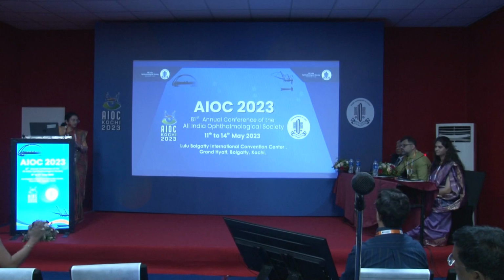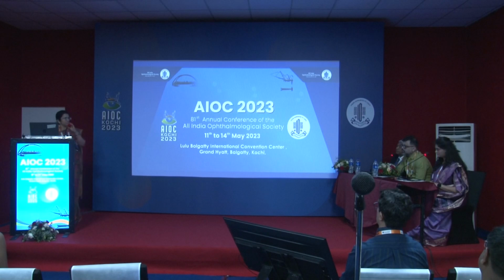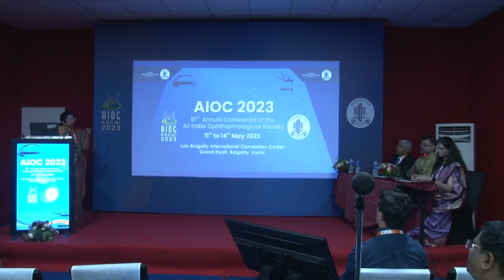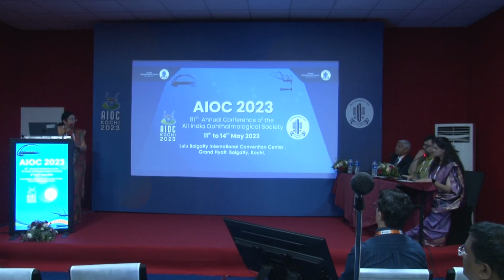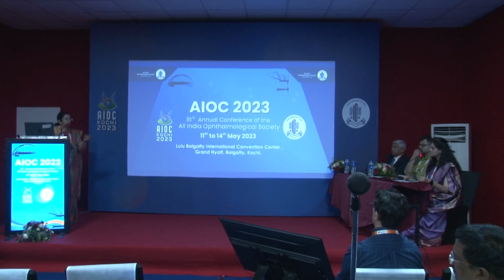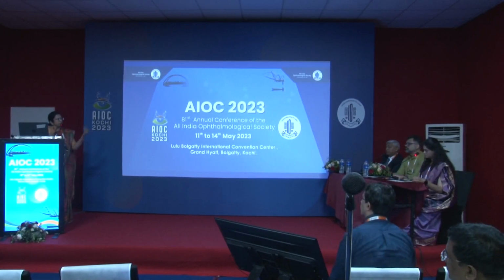I have to clarify. Which are the cases in which you would actually consider putting the posterior readings in the formula? Posterior astigmatism. For routine cases, we don't take it into account, but for toric IOL definitely. But the Barrett toric calculator has an inbuilt algorithm to calculate the posterior corneal astigmatism also, so we don't have to use it separately. It is all the more important in post-refractive eyes, unusual eyes, and outliers, where we definitely take it. Otherwise, even for normal toric, we don't use TK, we usually use the toric calculator.